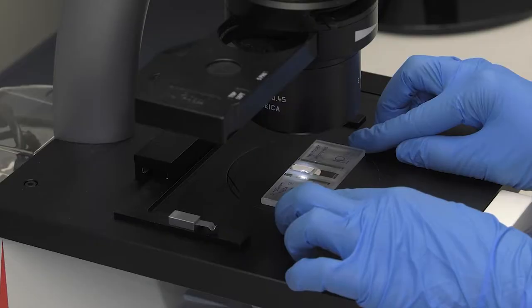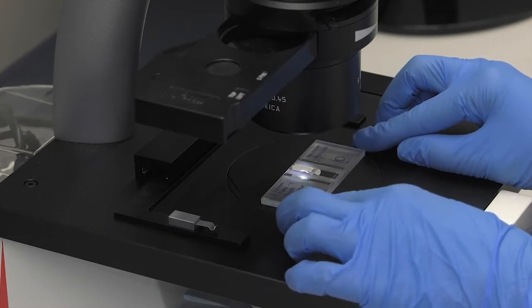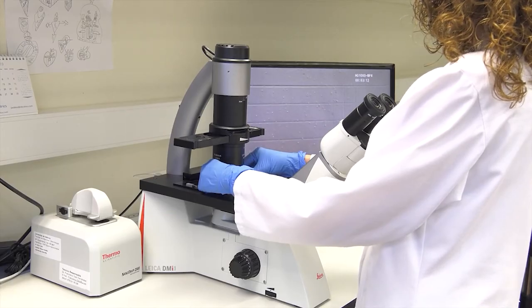The Neubauer chamber is a blood cell counting chamber that allows the microscope to determine the number of cells per unit volume of a liquid, which in the case of blood could be, for example, the number of erythrocytes per cubic millimeter.